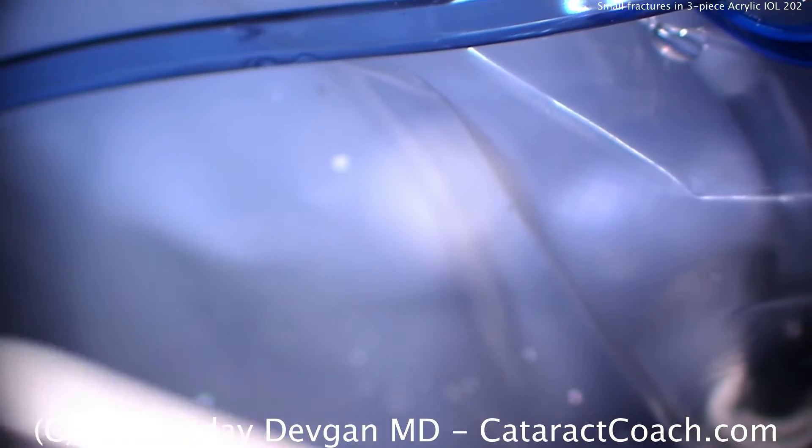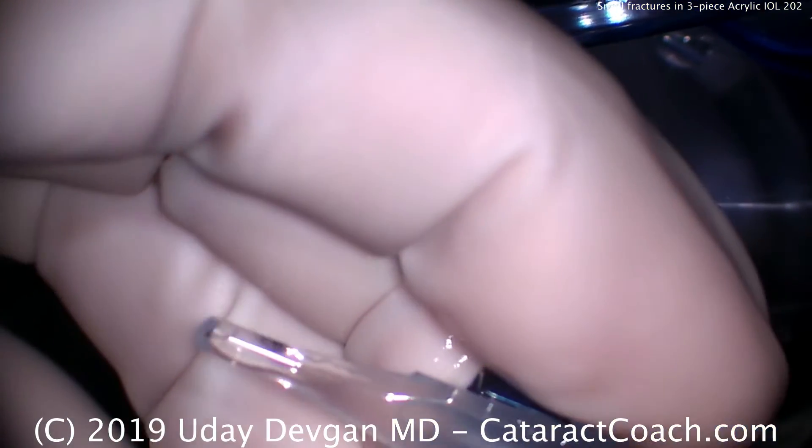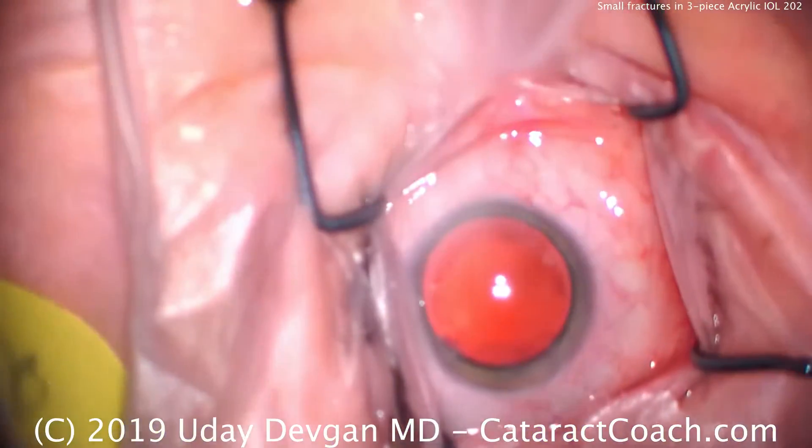Let's click it into the injector system. Beautiful. Advance it. Looks good — that looks great. And now let's put it inside the eye.